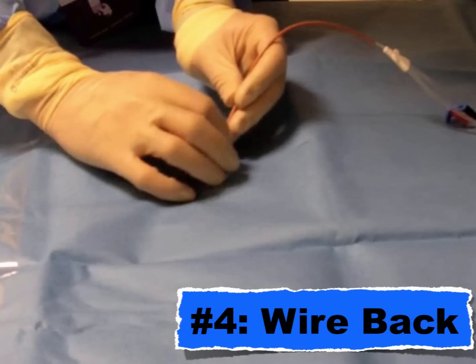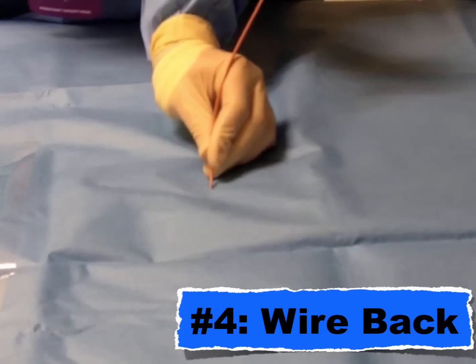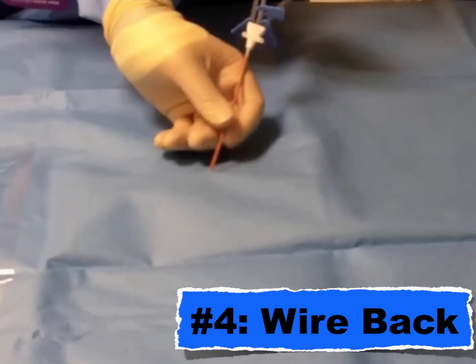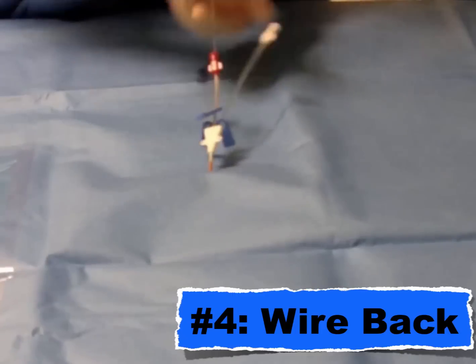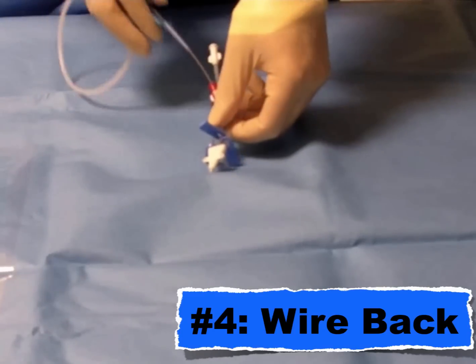The next tip is something I learned after getting blood splashed on my face or on my scrubs one too many times — and this is what do you do with that wire after you're done with it. It kind of hangs out on the bed, flops around, sometimes it drops on the floor and you need it again. Well, after you deploy that wire and you're starting to back it out of your central line, go ahead and find that plastic deployment kit that came with it and put that wire backwards back into that container.